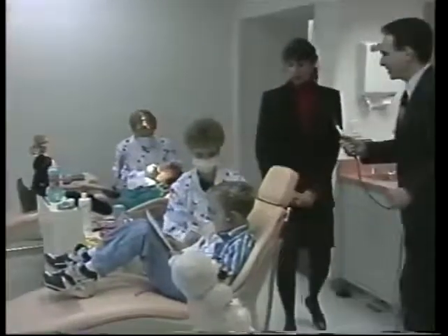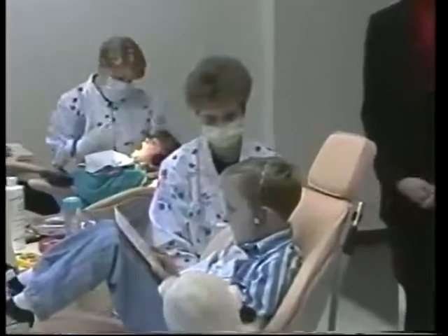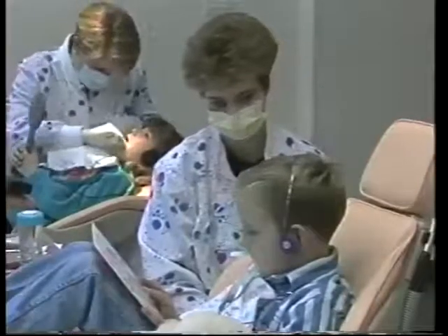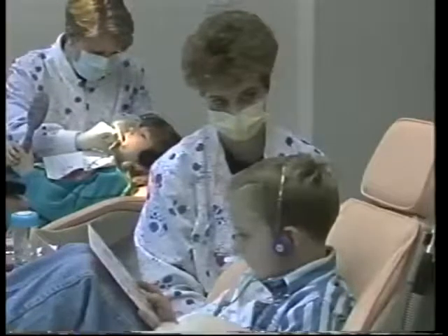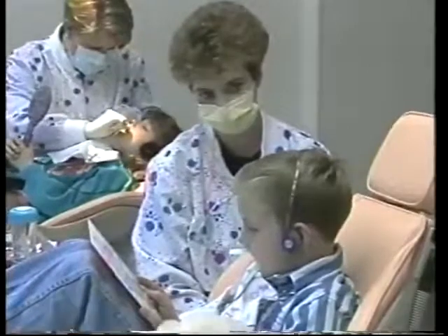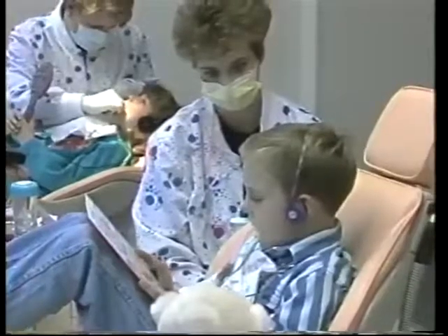Okay. We're getting a fluoride treatment, and we actually have different flavors, and the kids get to choose which flavor, so that makes it a little bit more fun and enjoyable. And that takes about 4 minutes. It just starts applying the actual medication directly to the teeth? Right, we have little trays that fit over the teeth, and we put a little bit of fluoride on each tray, so it just bathes the teeth for about 4 minutes.